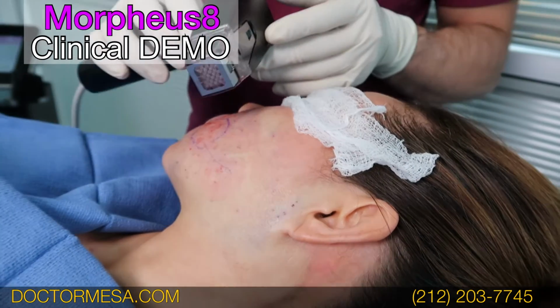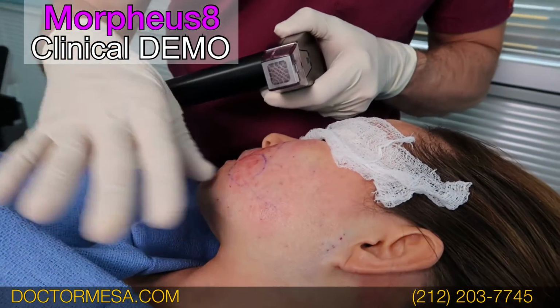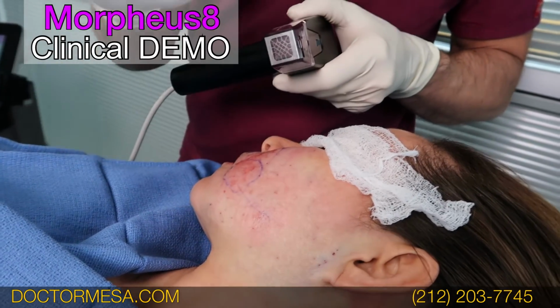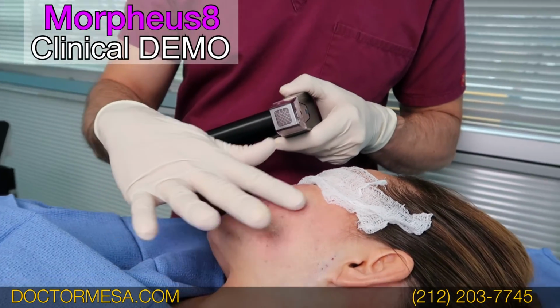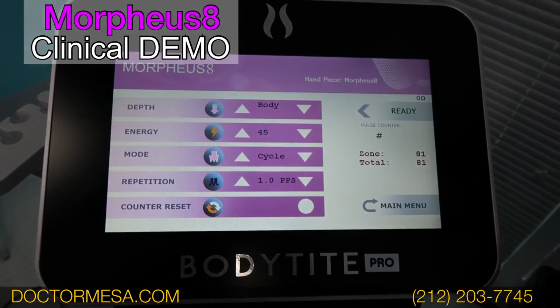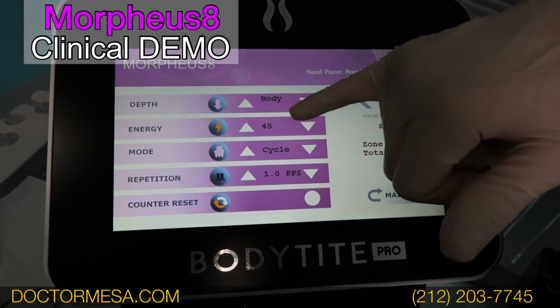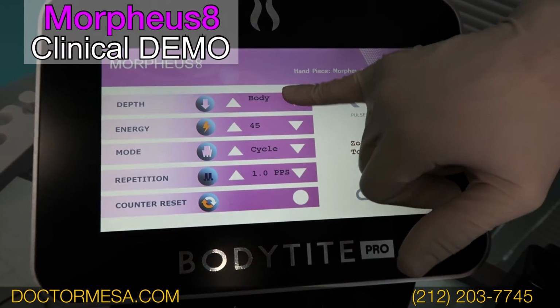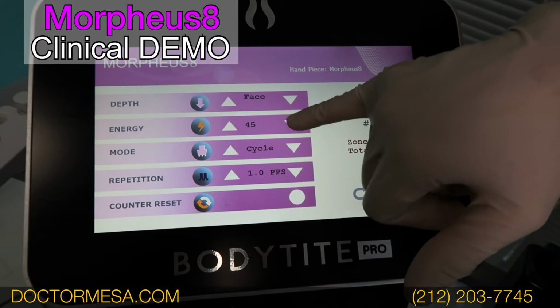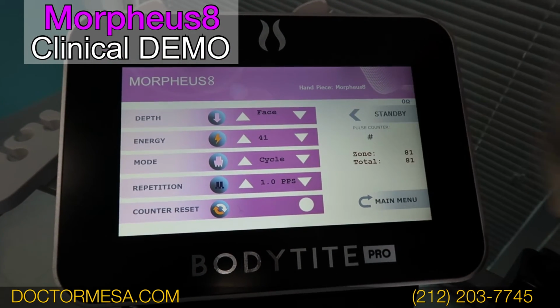So now that we have finished the body portion, that is the fat remodeling, we're going to switch the machine to the face mode that is going to produce just skin tightening of all this area. So now that we are done with the fat remodeling mode of the Morpheus8 that was in the body setting, now we're going to move to the face and going to decrease a little bit the energy, and we're going to continue with the cycle.